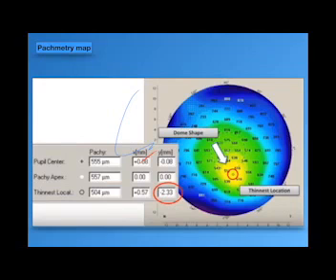If there is a protruded tongue in the back of the cornea or on the anterior of the cornea, you will suspect that, because we may find points which are in the normal or accepted range, but actually they are all borderline.